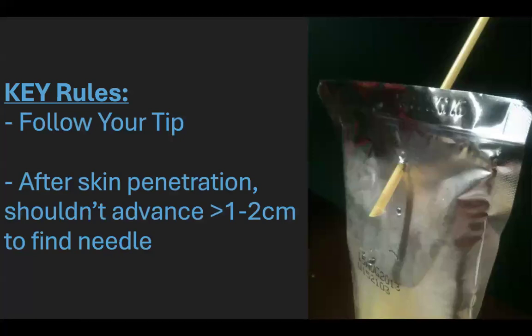I don't know if y'all have seen this too, but for some reason some people think that if they just keep jamming the needle in further, they'll find their needle. Sometimes the resident or whoever you're doing it with eventually finds their needle, and you realize it's buried deep relative to where you want to be. So one helpful thing to teach people is, if you've inserted your needle a good 2 centimeters and you don't see it yet, you shouldn't just keep advancing it. I even did a hip PENG on someone, and by the time they found their needle, it was buried somewhere in the depths of the pelvis, and I was like, oh geez, here we go.